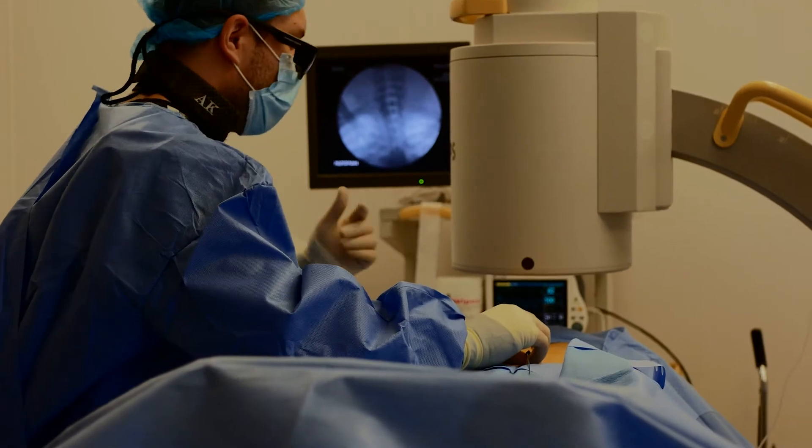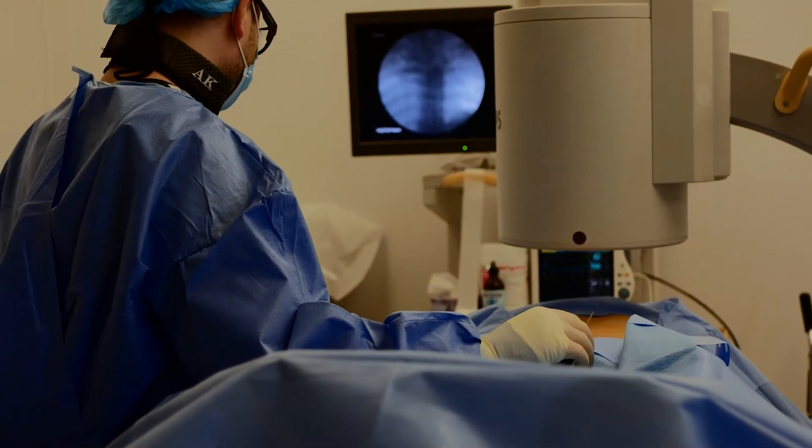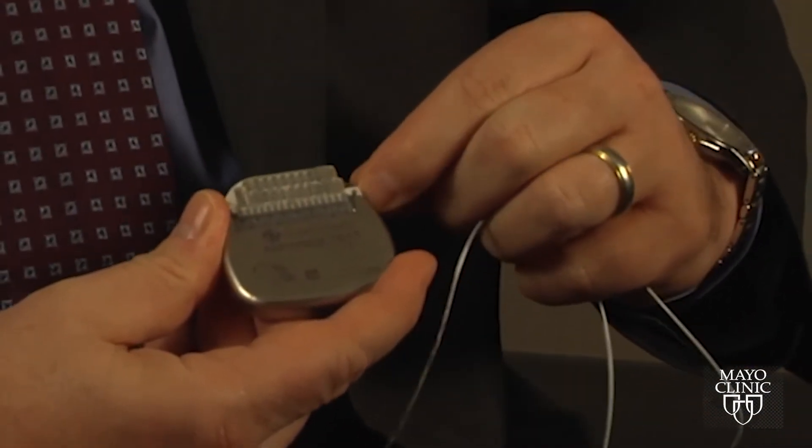The trial is a non-surgical way to find out if this treatment is helpful or beneficial to the patient. It simply involves placing a very thin electrode through a needle, then securing it, and the patient goes home with the electronic device to try stimulating and sending the electronic signal to see whether they get pain relief. It's a seven-day trial to find out if this is a good treatment option for the patient.